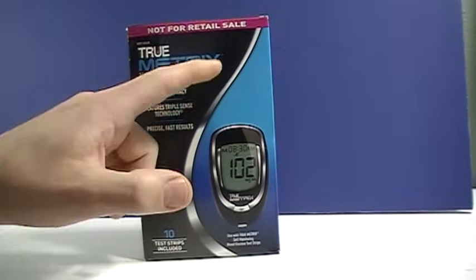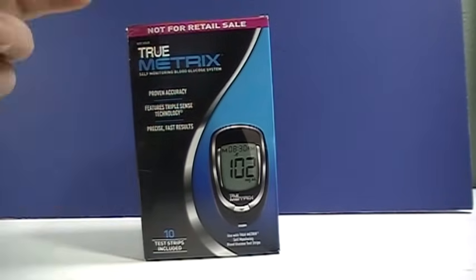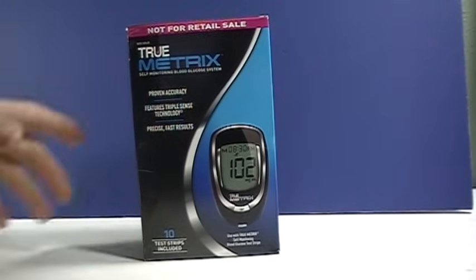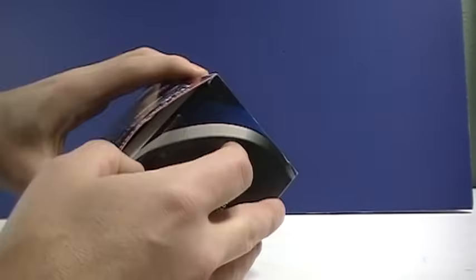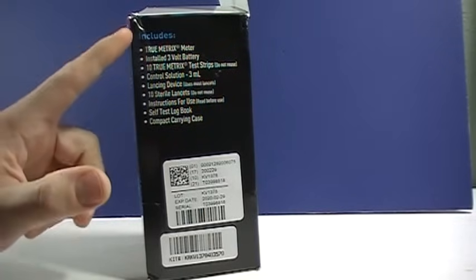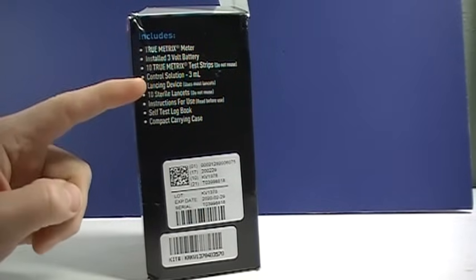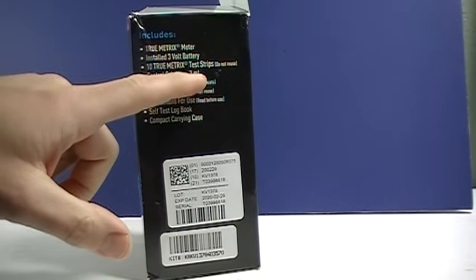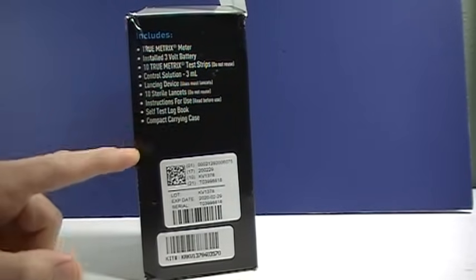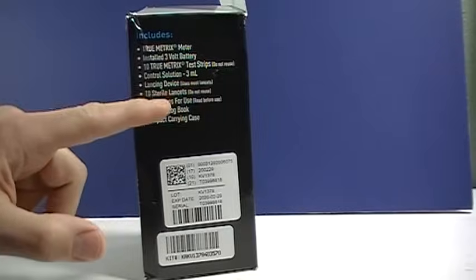Many pharmacies will sell it under their own name but it still will say True Metrics on it, one of the more affordable blood sugar machines out there. This kit includes the meter, comes with a battery installed, comes with 10 test strips to get started, control solution, the lancet device, lancets of course, instruction book and carrying case.